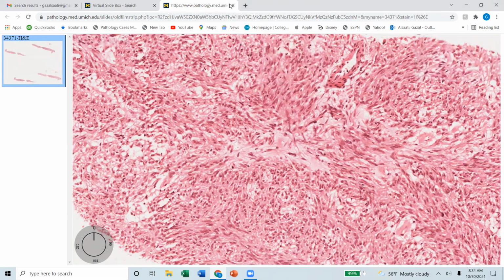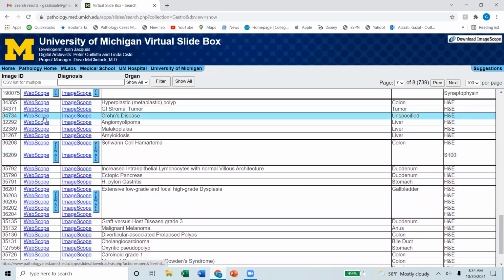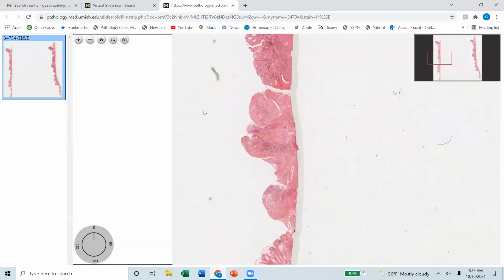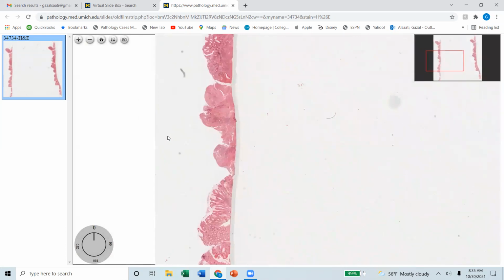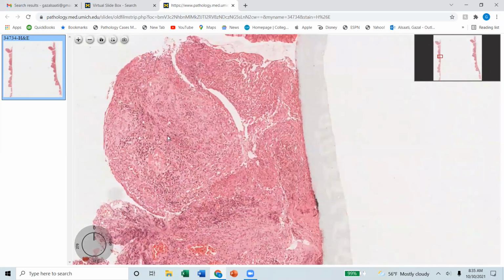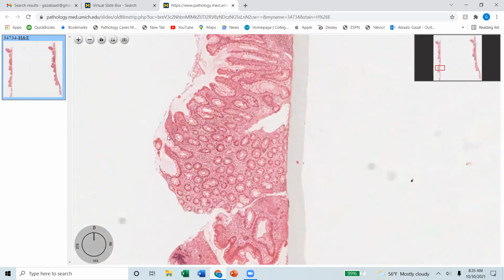Okay, moving on. I wish I can finish page 7 at least today. This way we can, Crohn's disease. We've done quick Crohn's before, but what you want to look for is granulomas, right? On low power, just by looking at low power, you find expansion here, and you go there and you find a beautiful granuloma. It's deep seated. It's in the exact place where you want it to be.